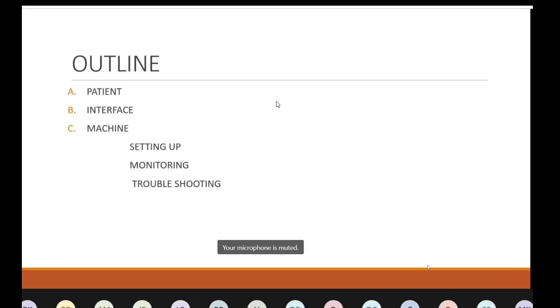There are three types of NIV oronasal masks that are available. We have all these three types available in our hospital. We have a small type of oronasal mask, a medium type, and a large type. So we have to carefully select which type we want to use for this patient. The top upper border of the oronasal mask should be at the bridge of the nose, and the lower border of the oronasal mask should be at the lower border of the lip. It should not be at the lower border of the chin.